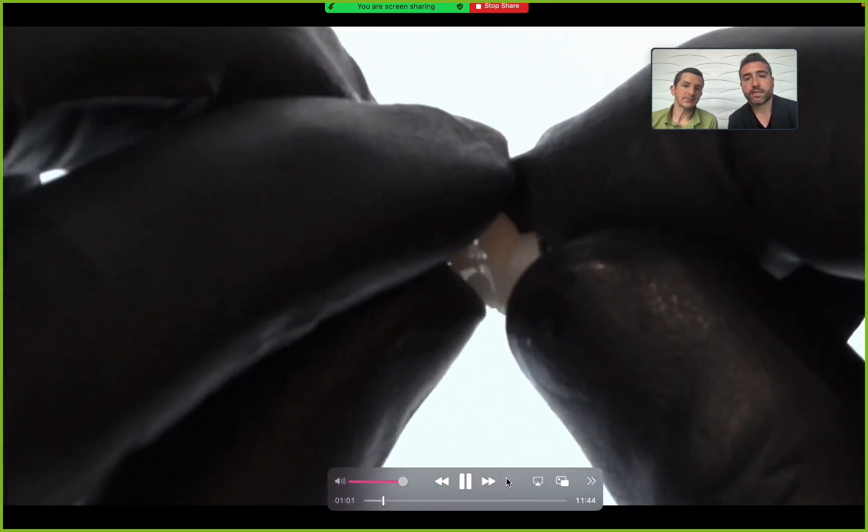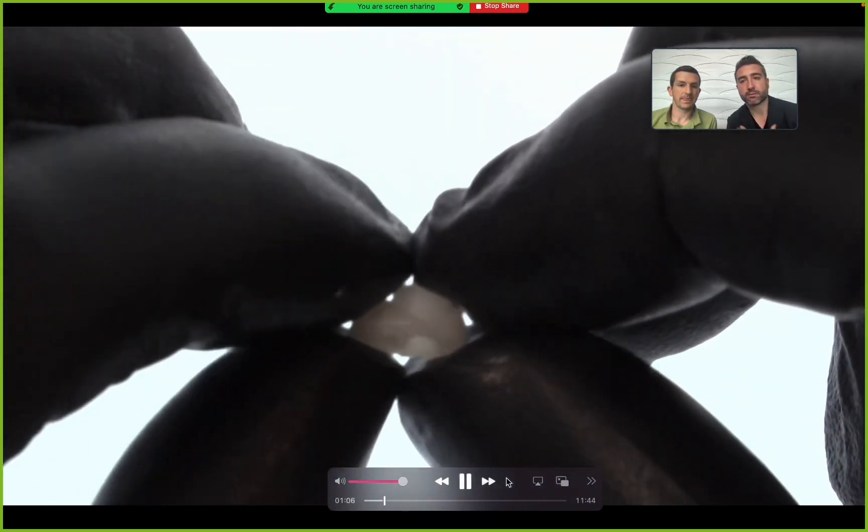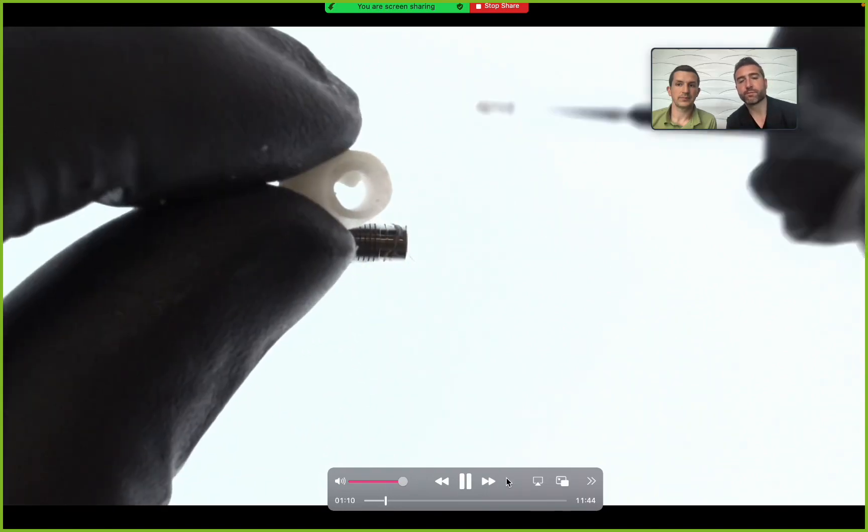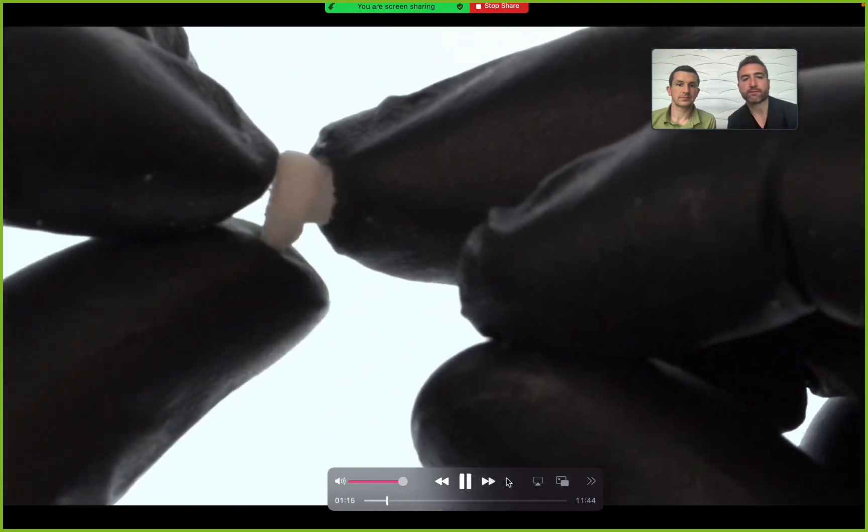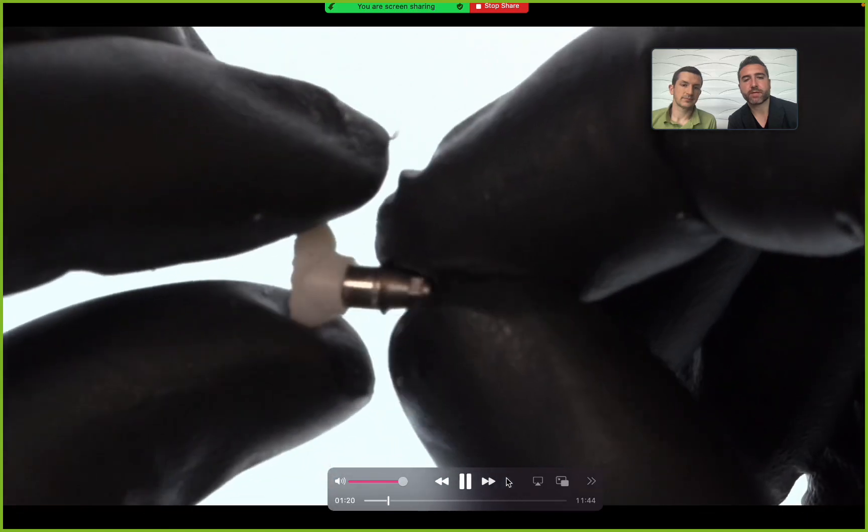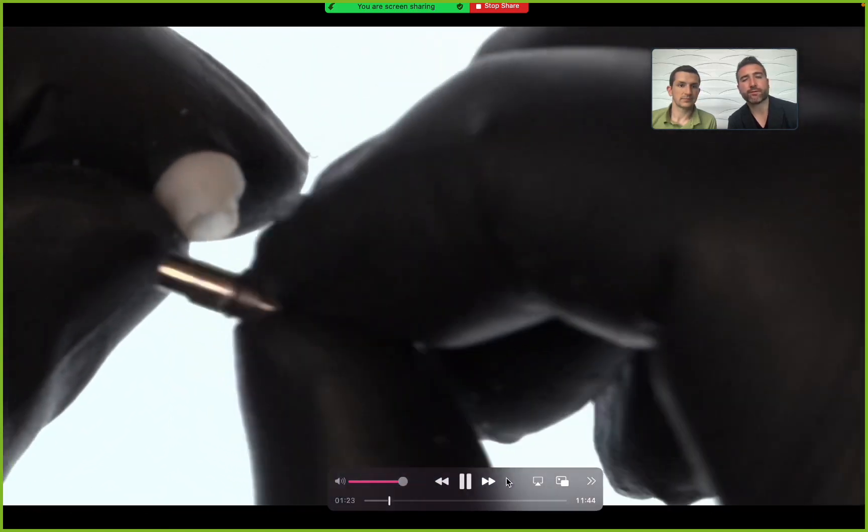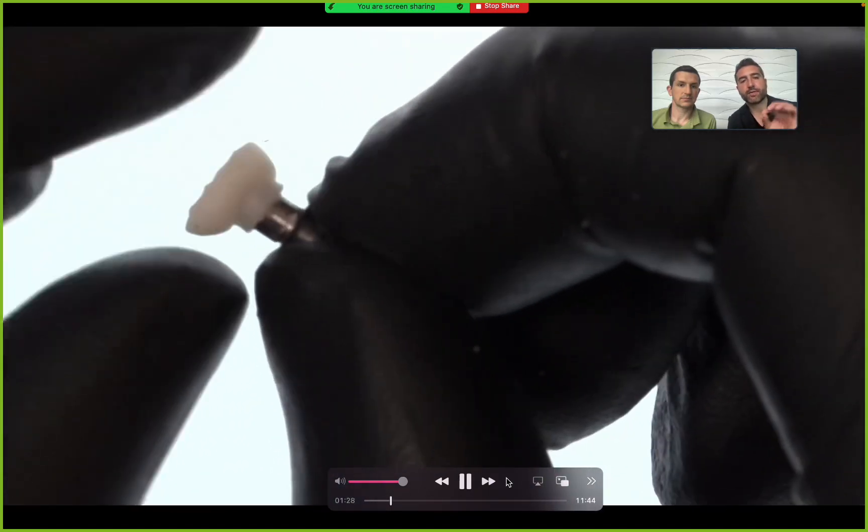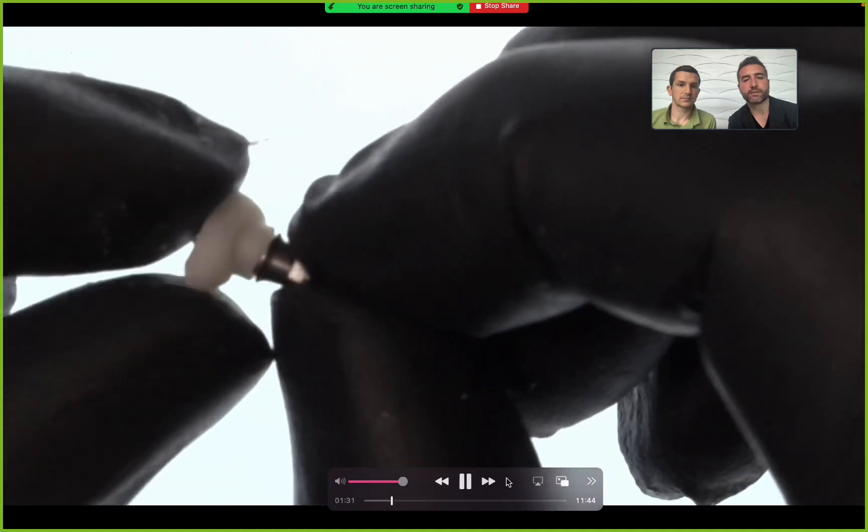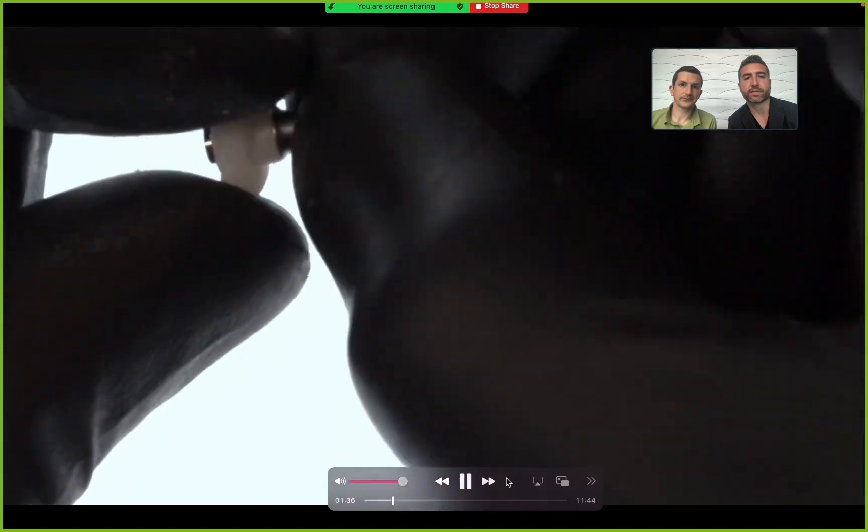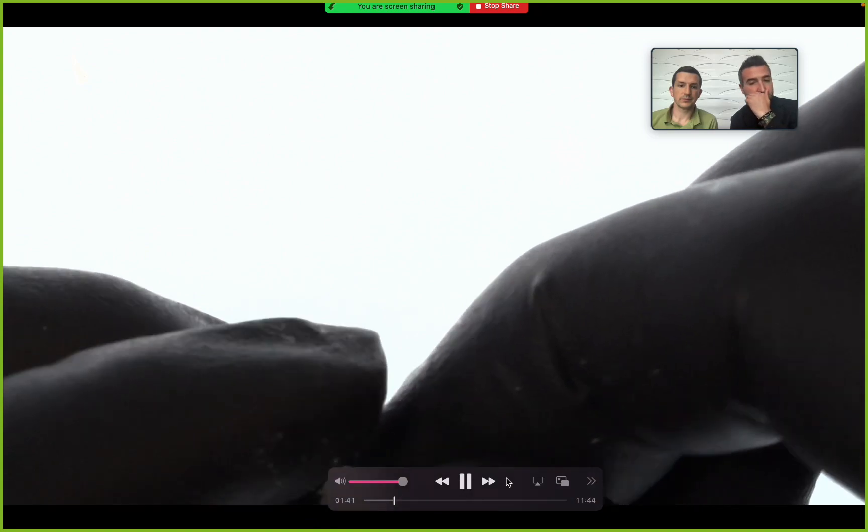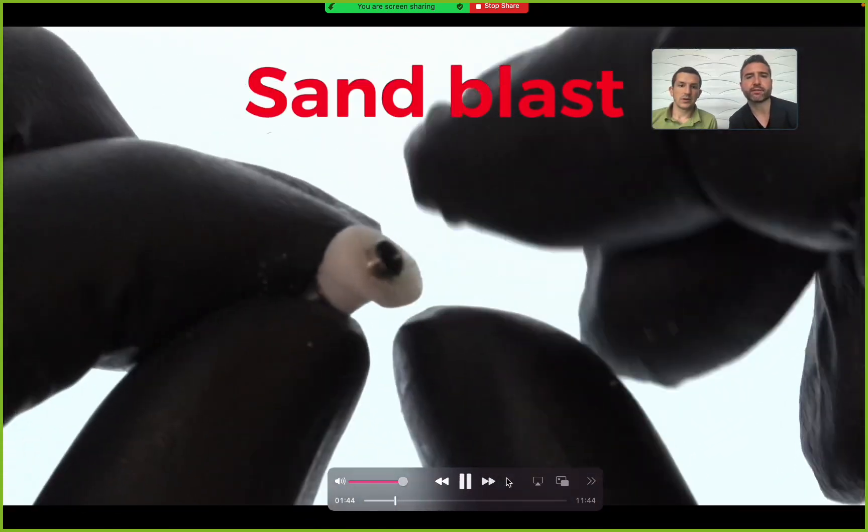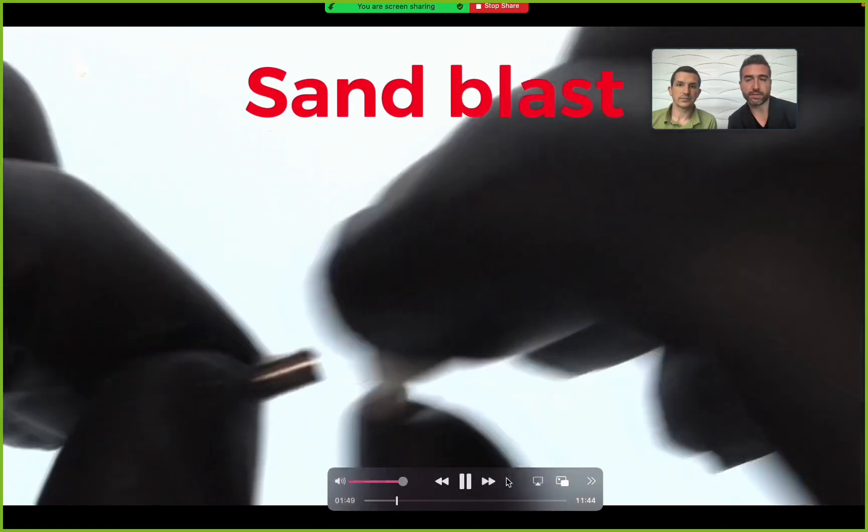I've had some screw loosening for the printed direct-to-fixture, but not enough to have anything come off. I notice at post-op follow-ups that sometimes I tighten the screw just a quarter or half turn. Here we have a printed custom healer on a TrueAbutment 5.5 millimeter tall titanium tie-base. This tie-base has an anti-rotation notch designed to allow the abutment piece to seat to the crown in one specific orientation. Notice we have a piece sticking out occlusal to the slice plane of the custom healer. Not a big deal - we can grind that off later or pick a smaller, less tall abutment.